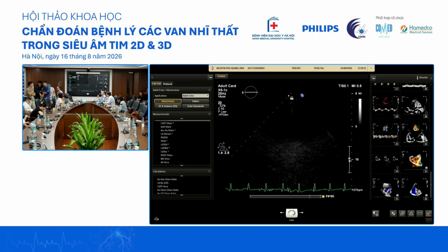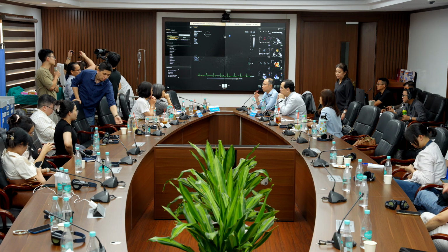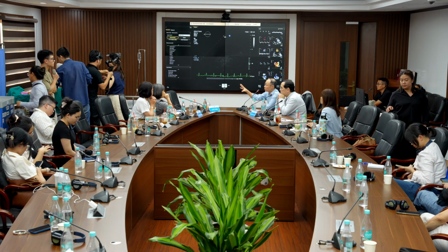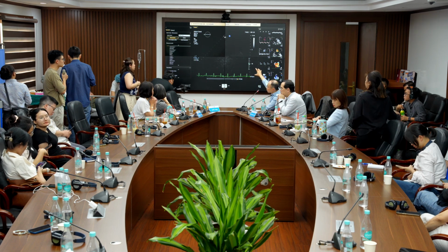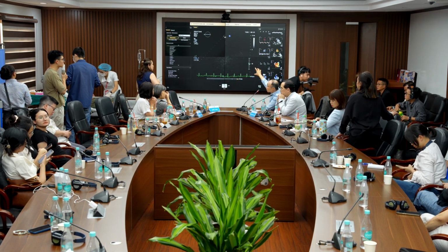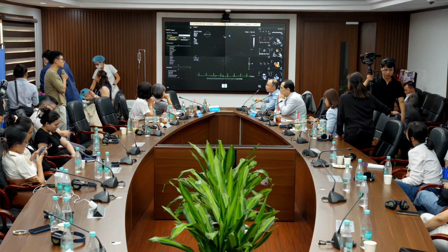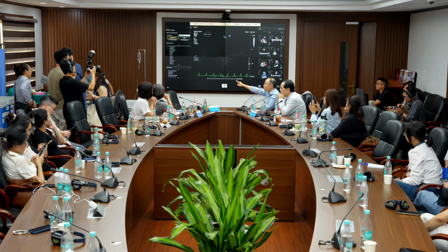Yeah. So I think the tricuspid valve morphology does not look abnormal. But I think what is striking is that even on two-dimensional parameters, although it wasn't specifically mentioned, during the short axis you can actually measure the vertical height, and that one looks about 34, 35. So that's already dilated. The short axis must be your third frame, I think.